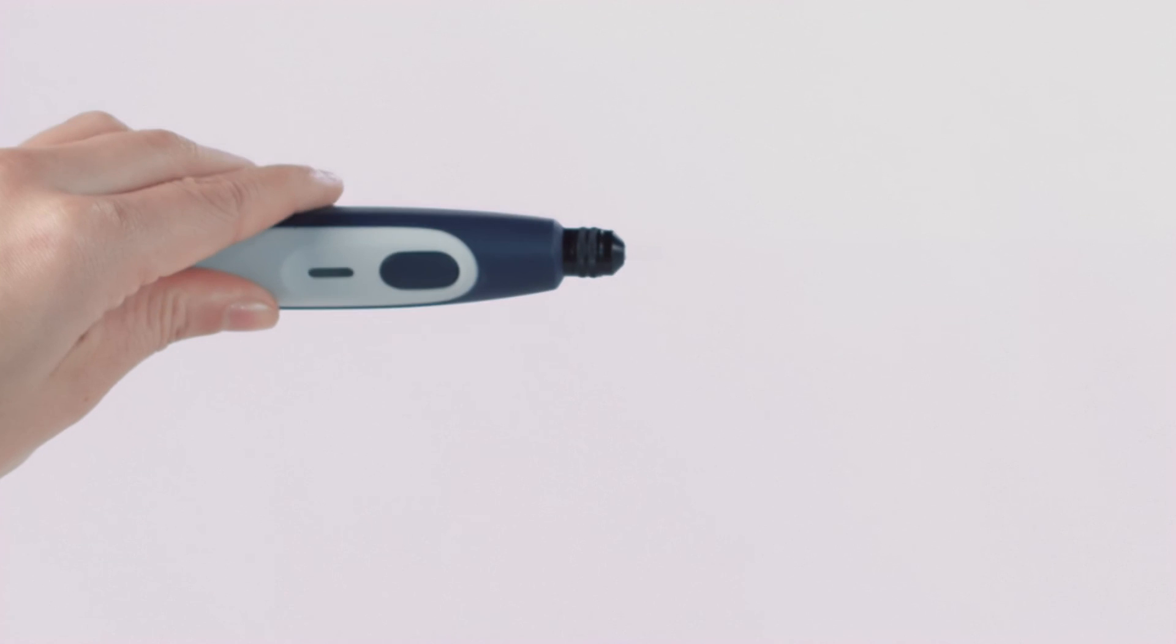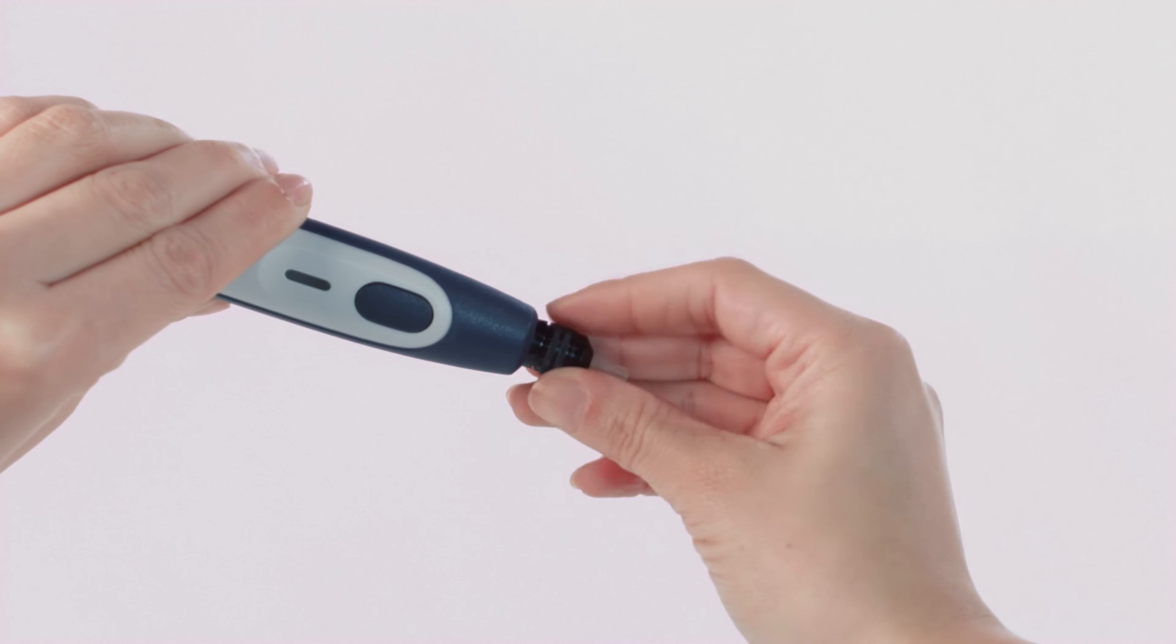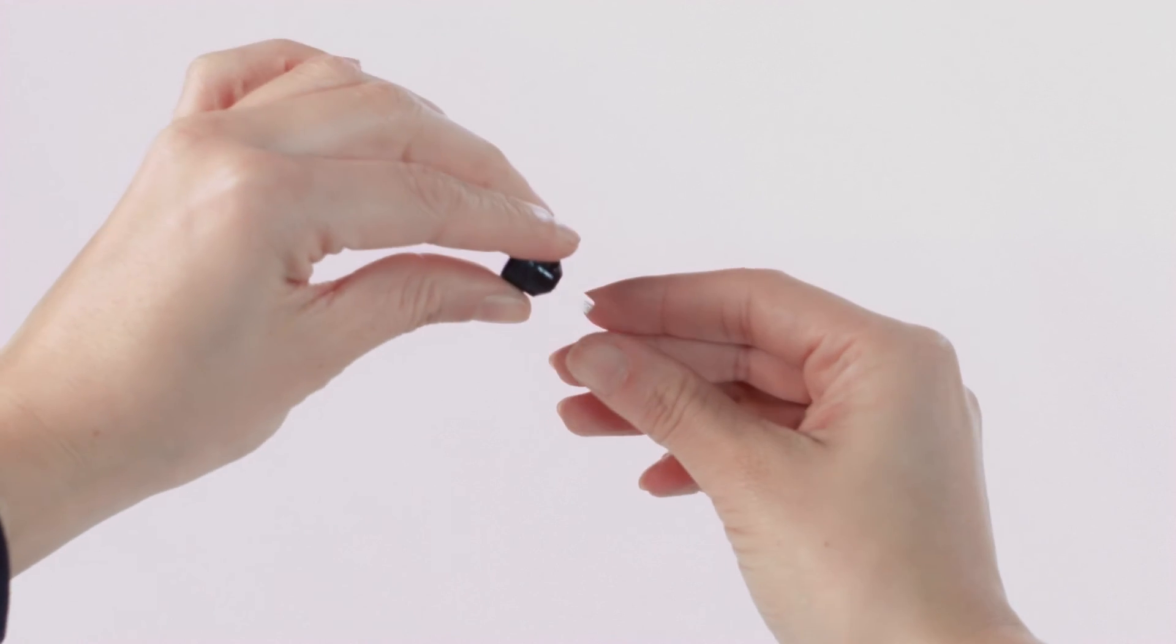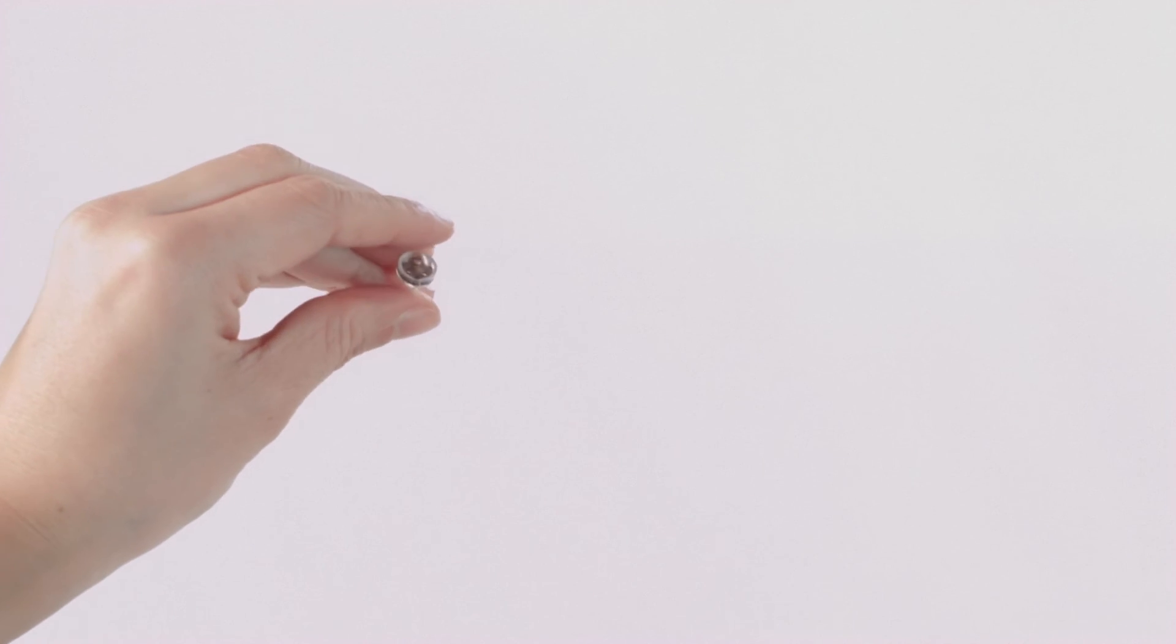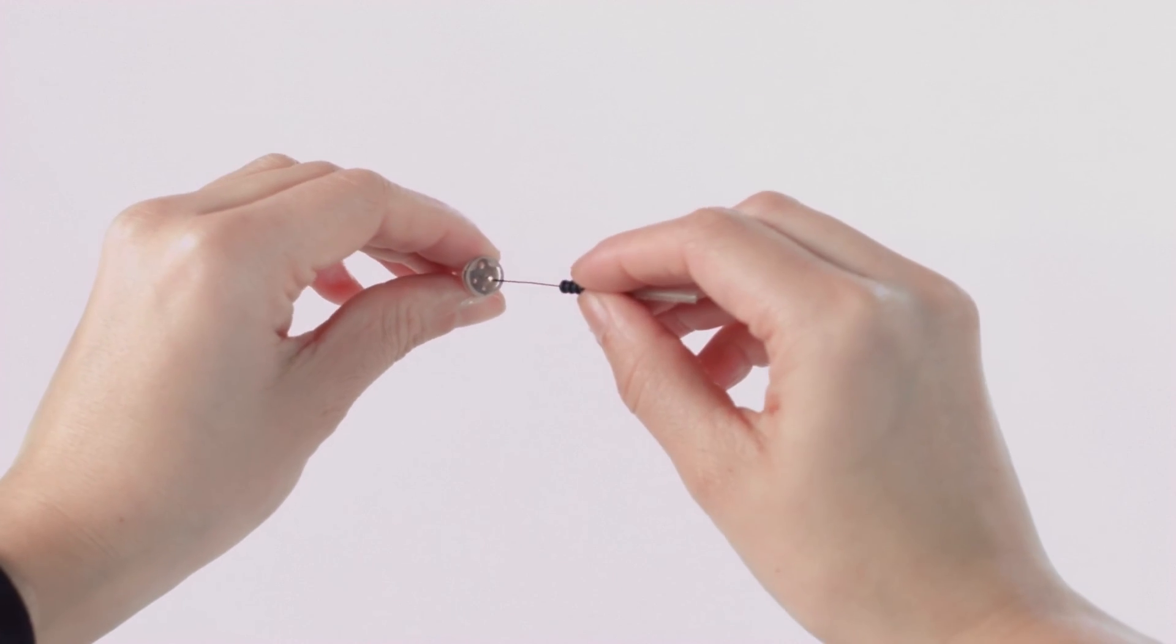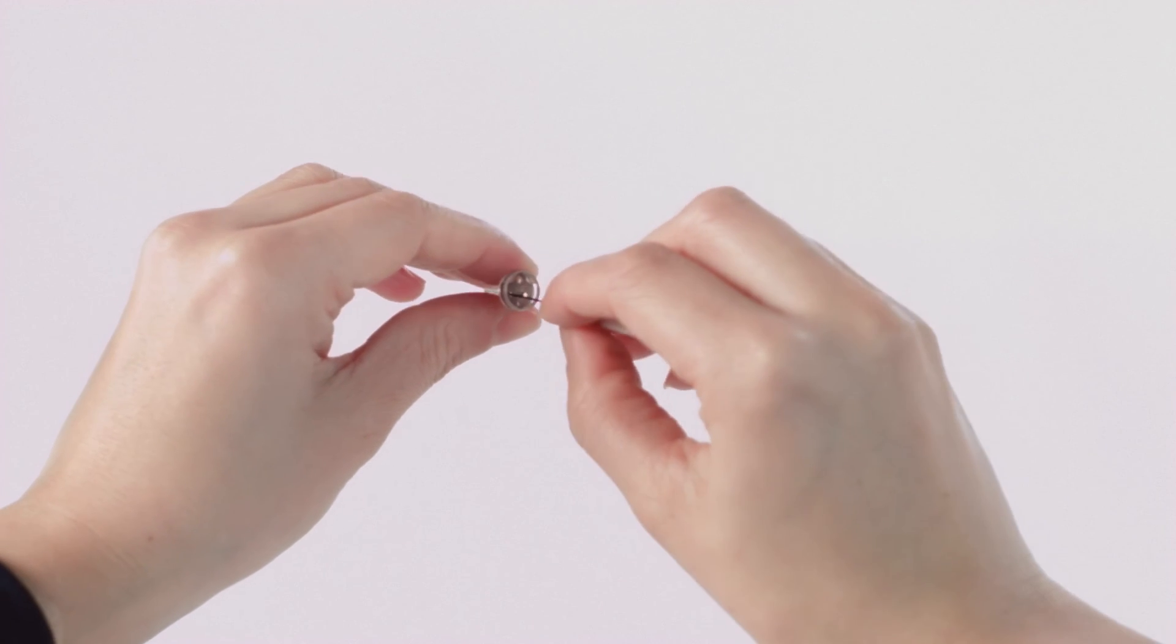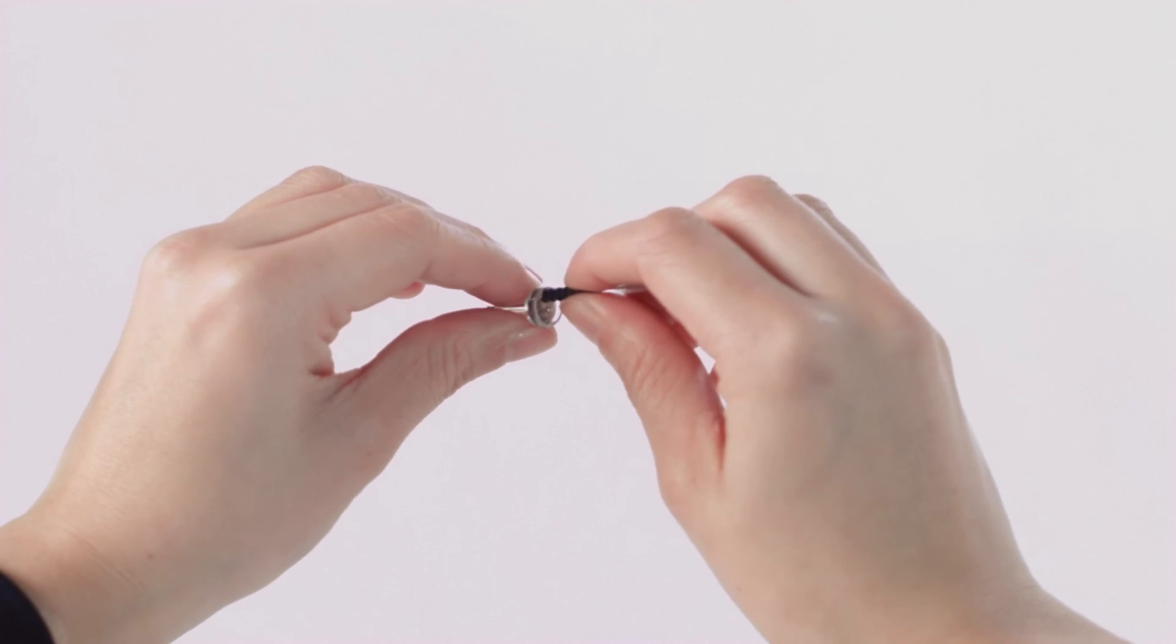To clean the probe tip, first unscrew the probe cap by turning it in a counter-clockwise direction. Never clean the probe tip while the tip is still attached to the probe. Take the plastic probe tip out of the probe and take the cleaning tool apart to find the thin brush and thin rigid plastic cord. Use the plastic cord or brush to push debris out of the probe tip. Always enter the probe tip from the rear to avoid accumulation of debris inside the vents.